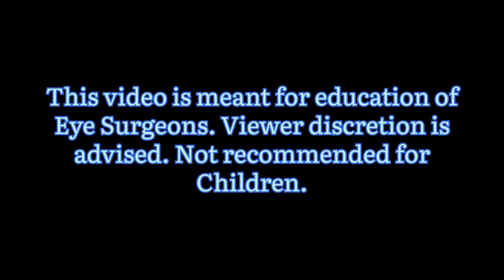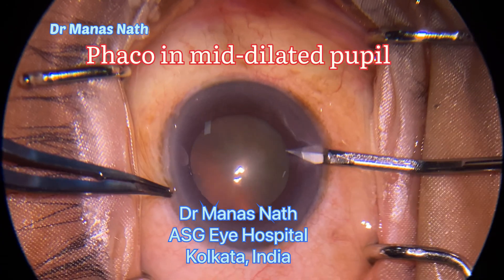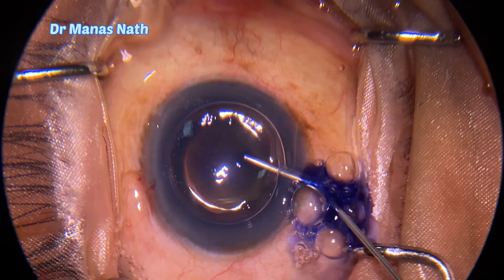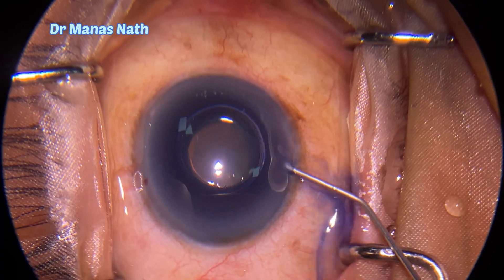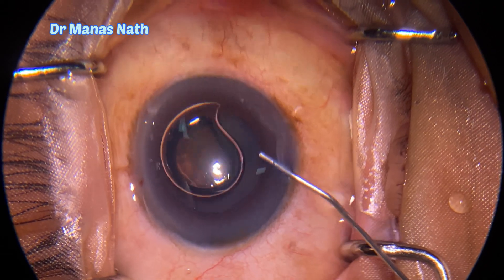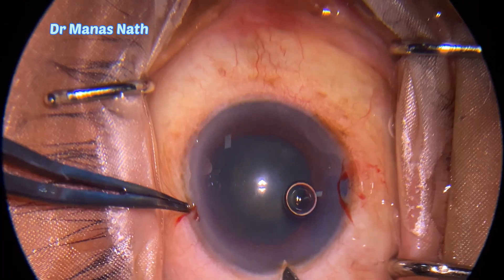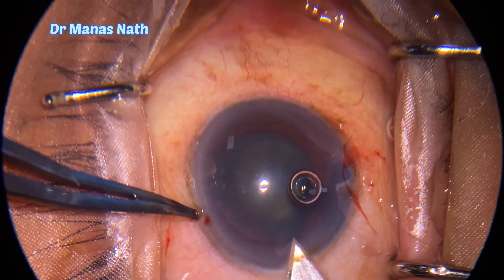Hello everyone, this video is on phacoemulsification in a miotic pupil with a relatively softer cataract; grade was around sclerosis 1 to 2. After making the side ports, stained the capsule, now injecting viscoelastics and now fashioning the main tunnels.